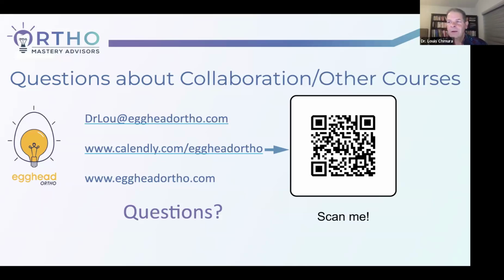What retractors are effective in retracting for occlusal photographs? Do I like the metal ones versus the clear ones? You know what? For the most part, it doesn't matter. It doesn't matter the material at all. But I liked wider ones for the occlusals, wider top to bottom.